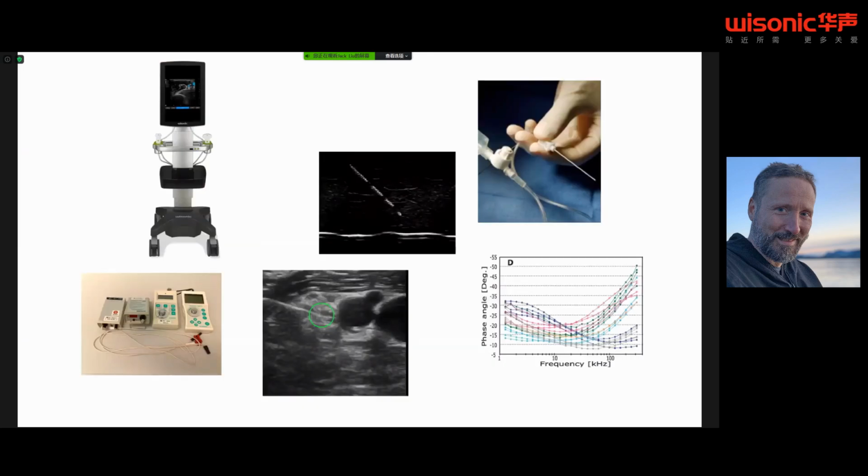In my presentation, I have introduced several technologies that can be used to improve safety during regional anesthesia procedures. However, I must say there is no good evidence that we really can reduce complication rates by using pressure monitoring, dual guidance, needle tracking, or impedance. It is more a matter of common sense and at the end, a personal decision if we want to adapt these technologies. And another question is, of course, should we use one or several techniques in combination? And I must admit, at the end of my lecture, I have no good answer for this.